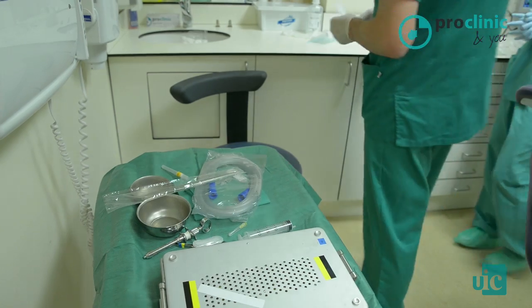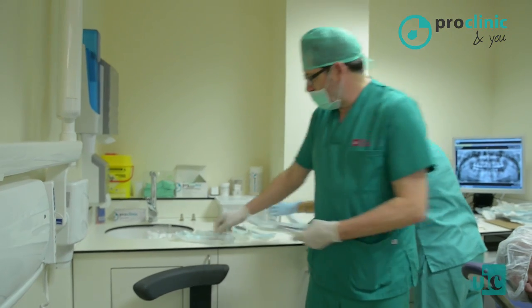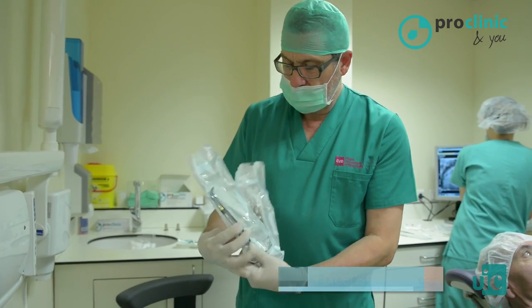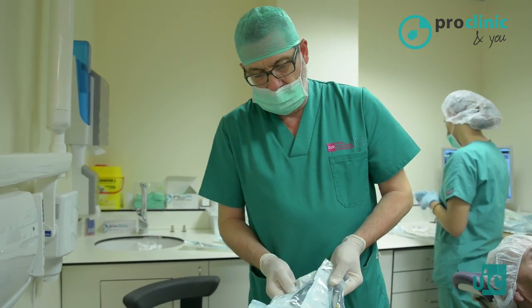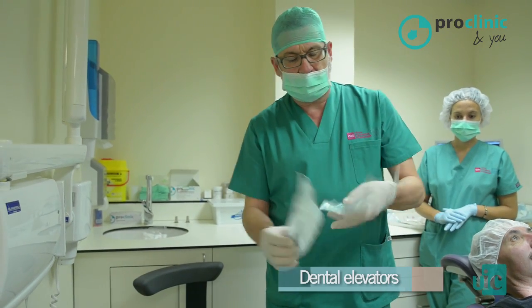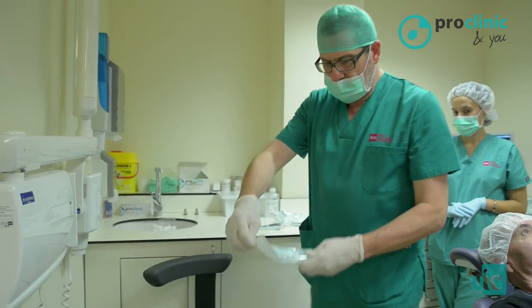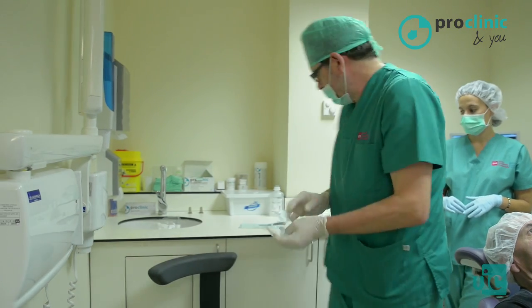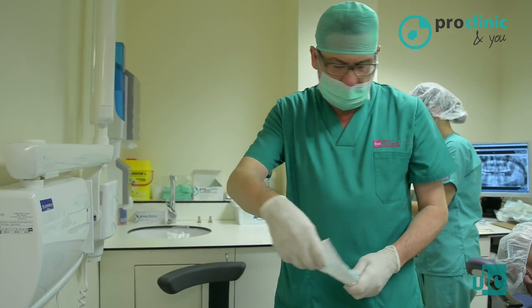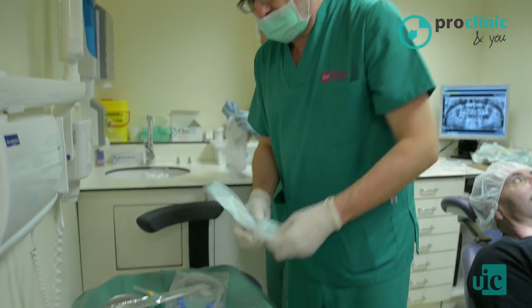The specific instruments to perform a tooth extraction are basically forceps that are similar to pliers, and dental elevators, which are instruments that we use to perform the tooth luxation and syndesmotomy. This present case is the extraction of a second lower premolar, 3.5, due to periodontal reasons.